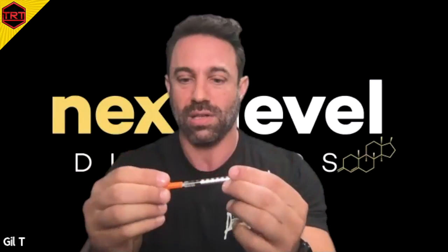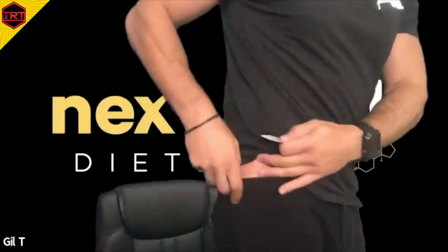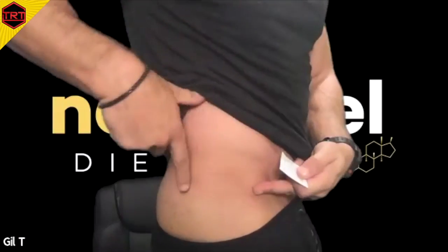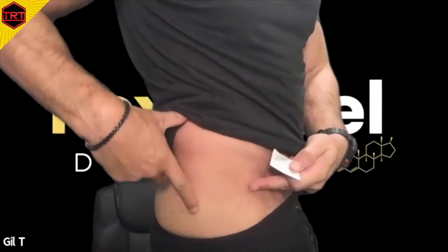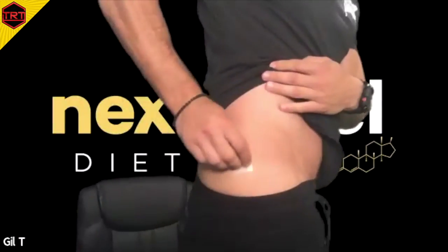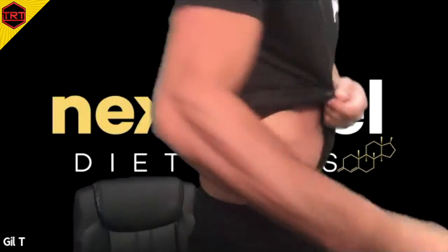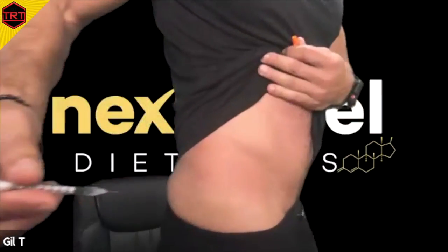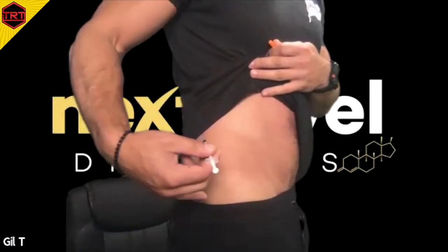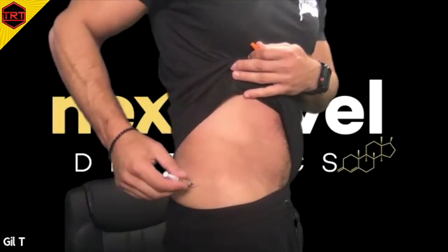As with any injection, you're going to start with prep using an alcohol wipe. We're going to find the area — here's my anterior superior iliac spine, here's the posterior iliac crest, and right in this area here is going to be the gluteus medius or ventroglute. Start with small circles in the center, slightly go out and about. Then you want to relax that leg by standing on the opposite leg so the muscle is relaxed — you don't want to kick your leg out to the side because that activates it. And then just go right in.